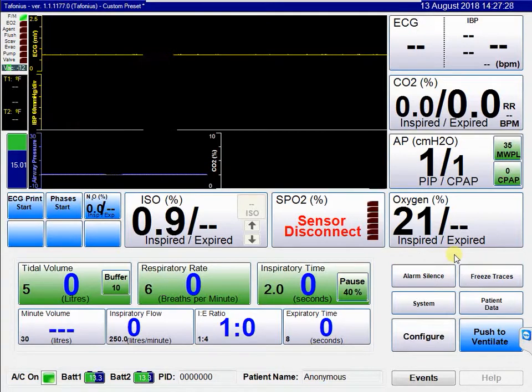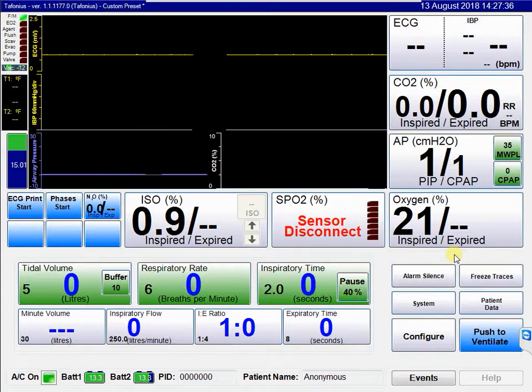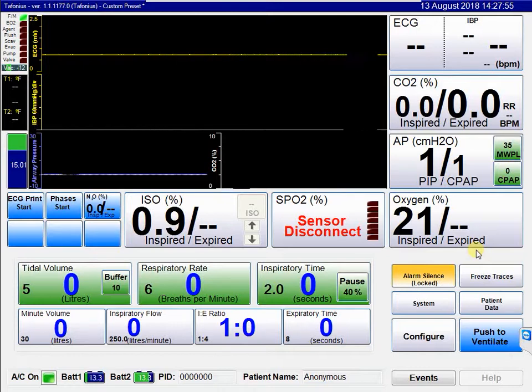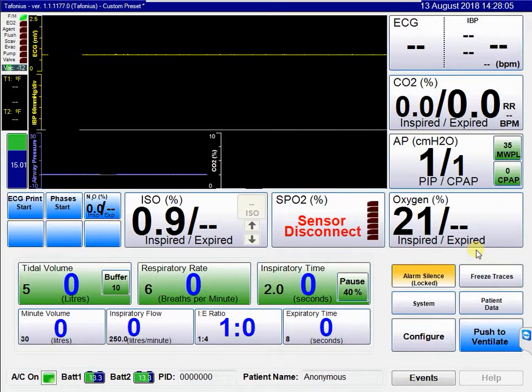The other way the alarm silence button can be used is to silence a repeated alarm — for example, an ECG heart rate alarm — where you don't want to silence all alarms in the system, but you're aware of the ECG alarm and don't want repeated reminders. Press and hold the alarm silence button until it says locked. Once locked, if that alarm occurs it will no longer be audible; it will just have a flashing border to the relevant button. Any other alarm, such as a CO2 high, would still break through as an audible alarm.